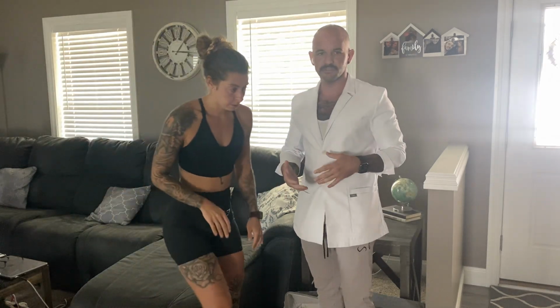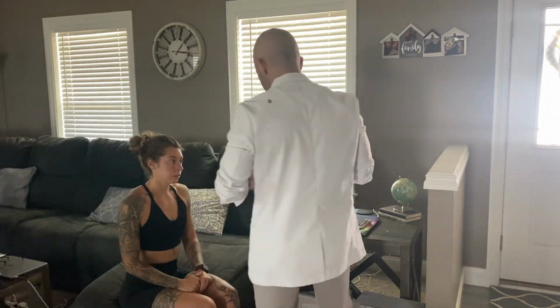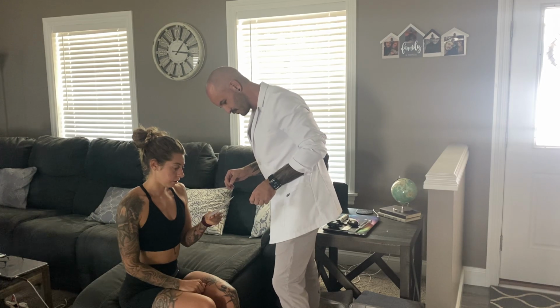And gait was appropriate. I didn't see any swaying or any balance issues. Legs move symmetrically. I didn't see any deformities. I've got to grab the Rosenbaum chart. Okay, so we're testing near vision with this. I'll have you hold it 14 inches from your face and then read the smallest line possible.